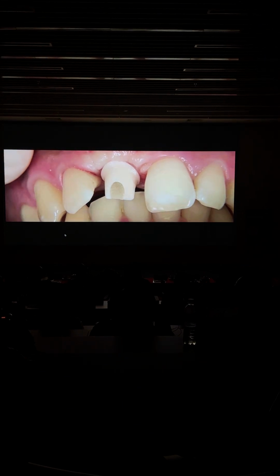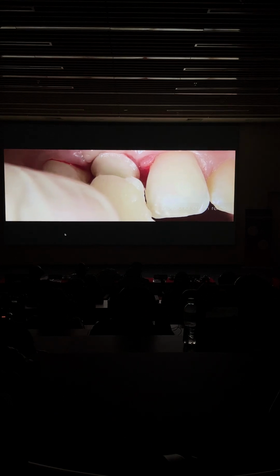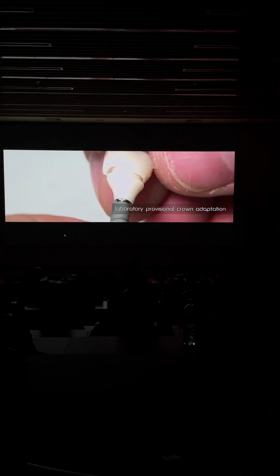Basically, we ask the patient to come a month later. And within a month, you already see how the papillae are coming back. What is important is to have good surface contact between the teeth and the tooth. So I need good interproximal contact to guarantee that this papilla will come down to the space allocated.